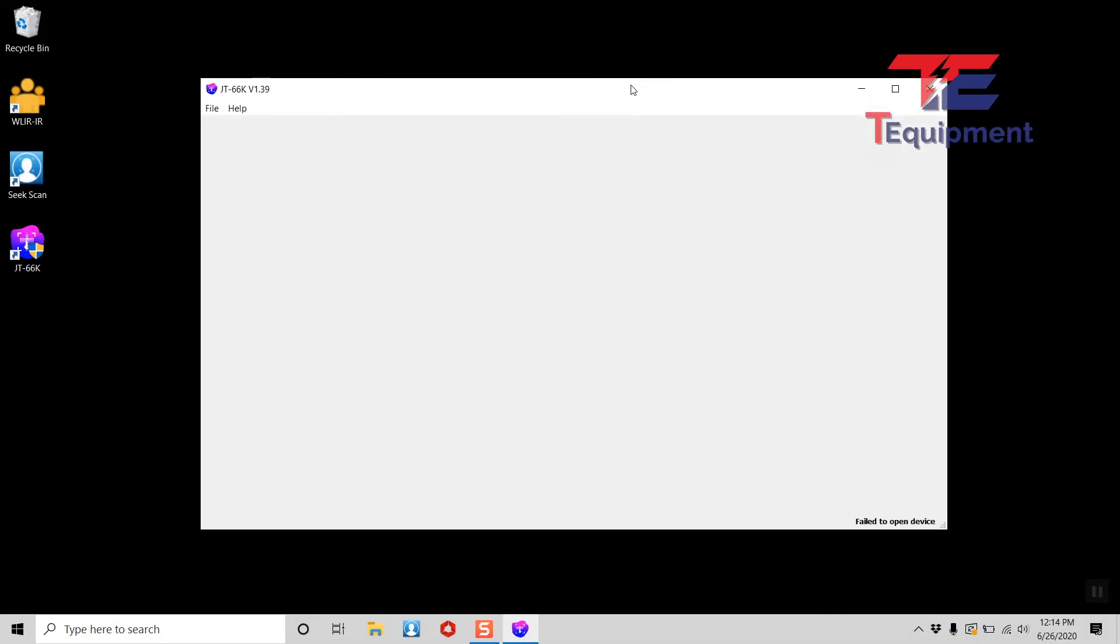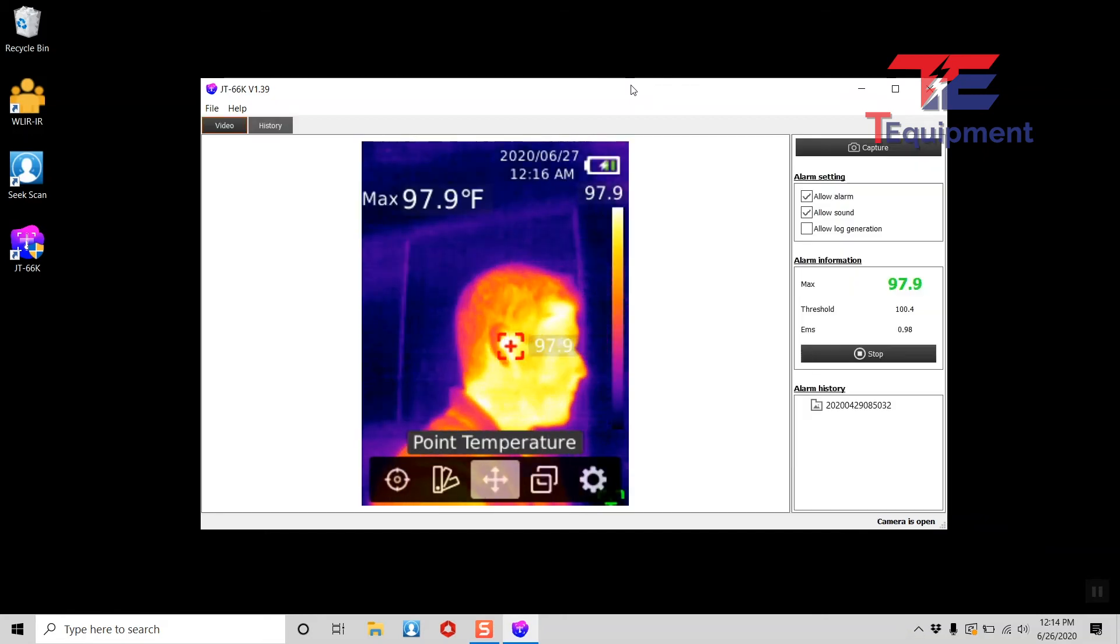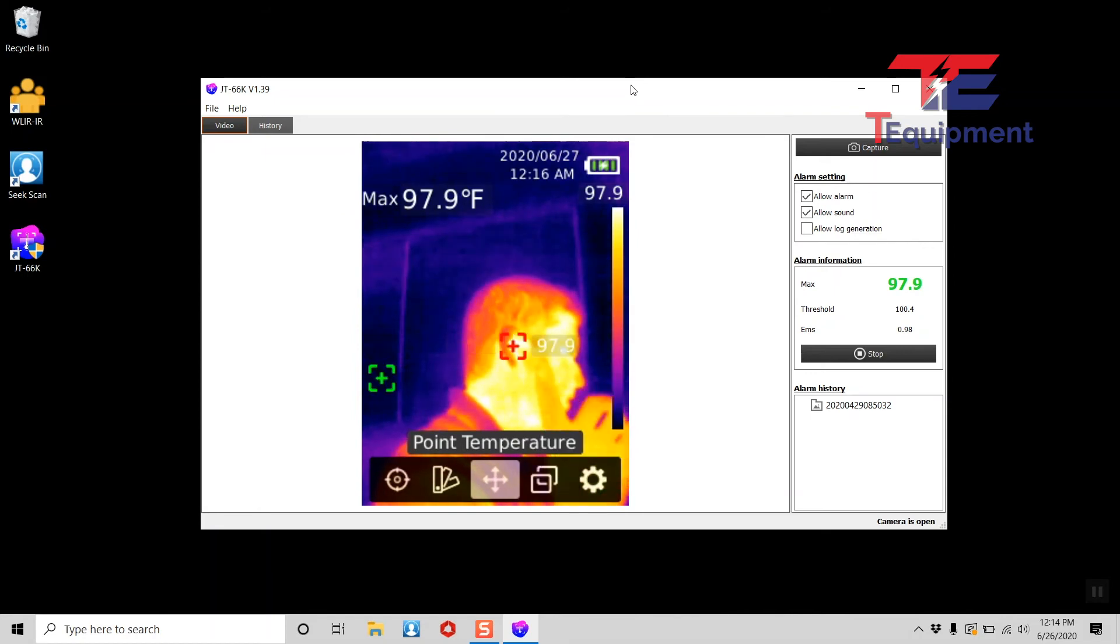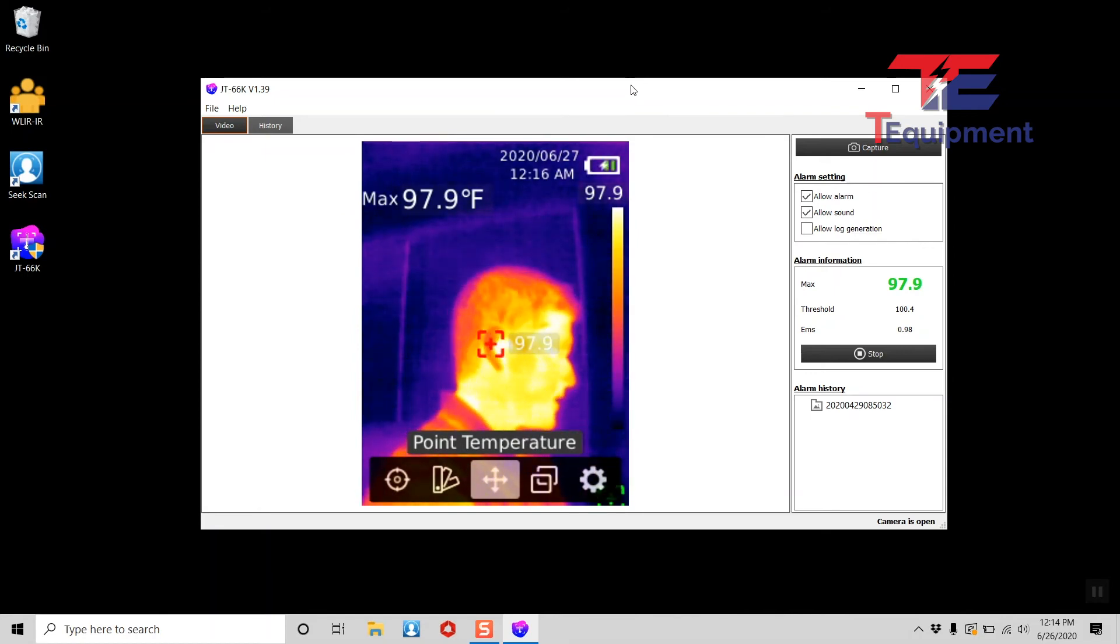So now the application is installed. Don't worry, this looks like there's nothing in here. This is actually just the application itself until you plug in your unit. So I'm going to go ahead and plug the unit in and notice that it's giving me the side profile. It's looking at me from the side here currently.